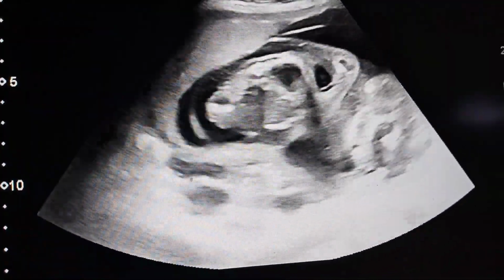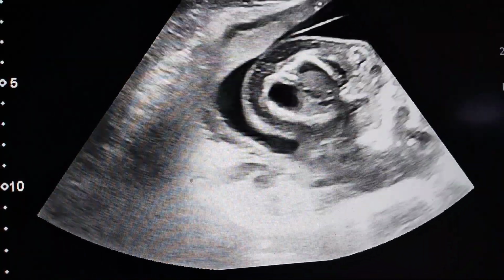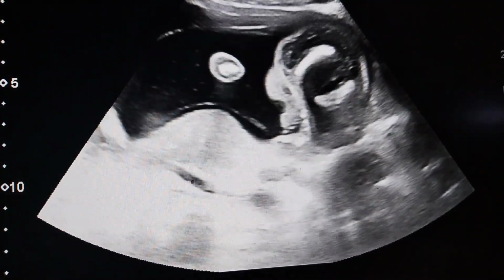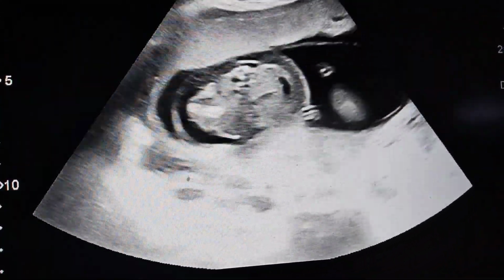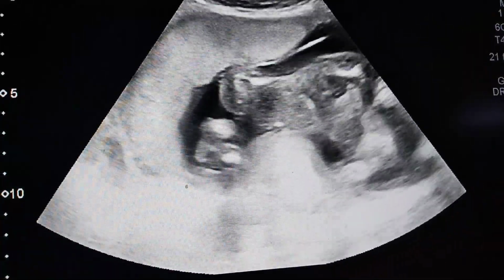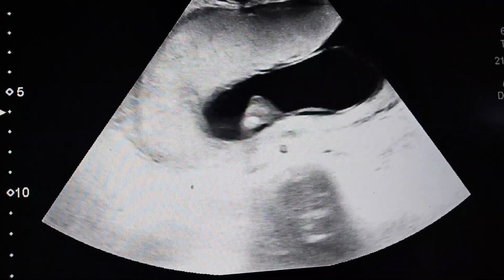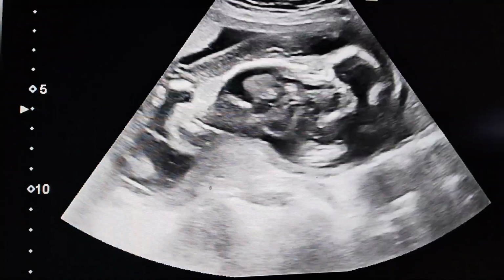And then the fourth one is there may be some lymphatic obstruction that may be due to Turner syndrome or due to the hygroma. When there is a lymphatic obstruction, we should see the fetal sex, and then we should see the cystic hygroma and any other abnormalities which we can find in the Turner syndrome. You can read about Turner syndrome in the literature.